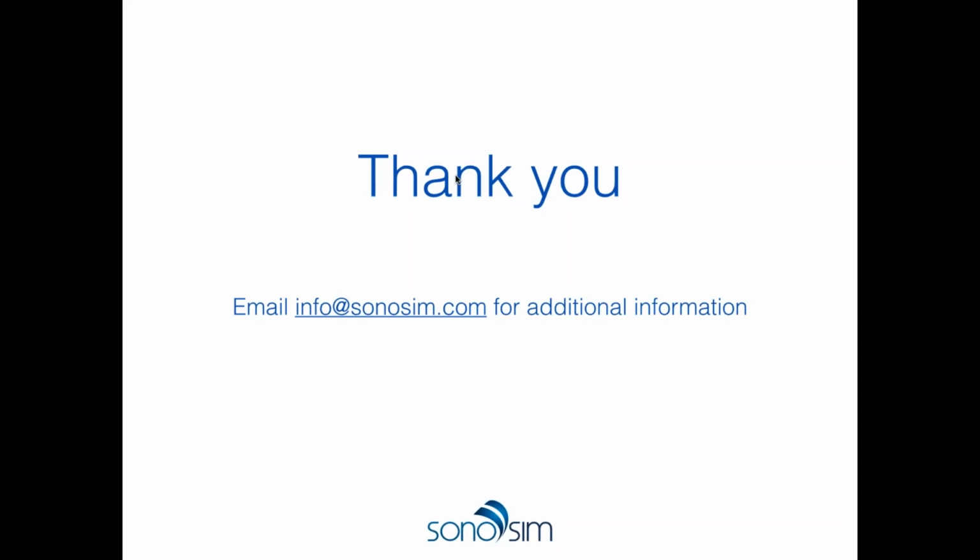We really couldn't imagine a use case where a student would begin placing the live scan tags either on a fellow student or a teddy bear or some other mannequin on their own time. Rather, that live scan technology is generally utilized in a simulation center environment, and again, the students can get their hands-on training through the self-directed program.